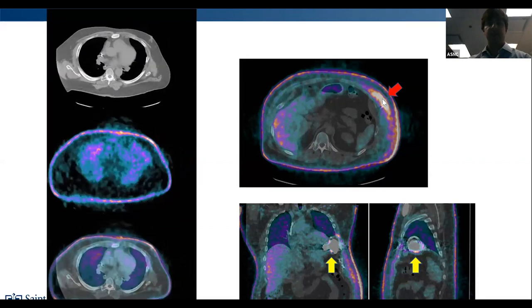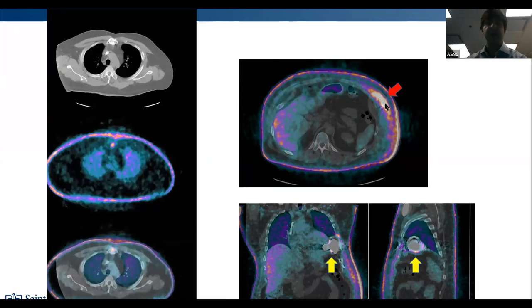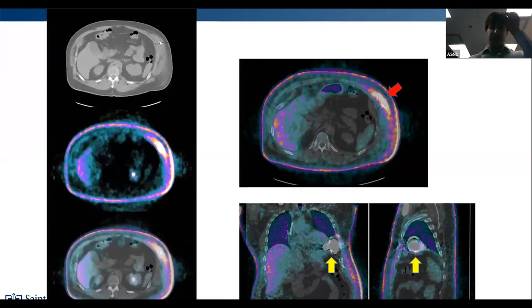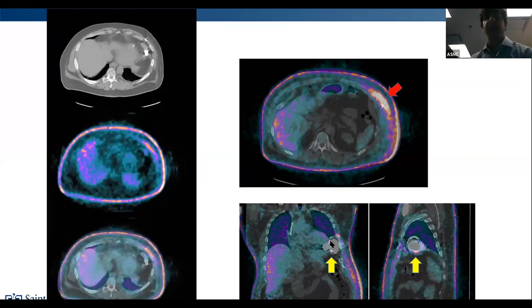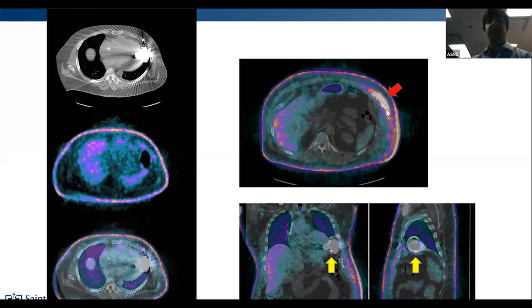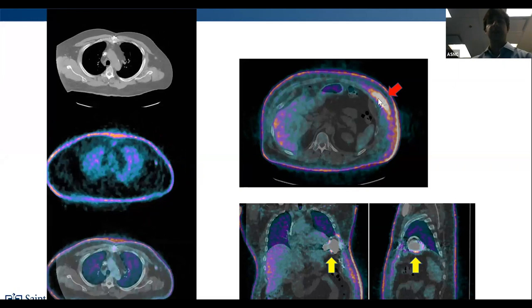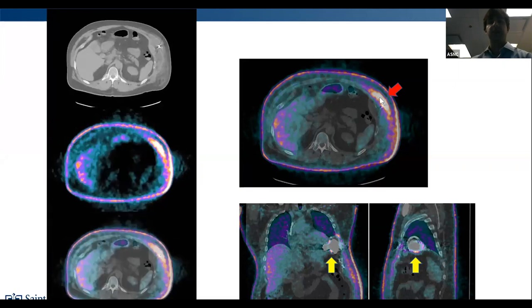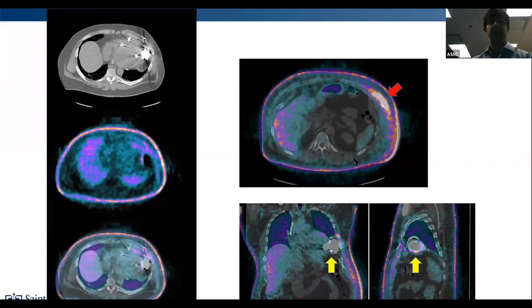There's attenuation corrected and uncorrected images. It's important to look at both sets of images, particularly around areas of the LVAD, because there can be major artifacts, obviously, when you use the attenuation correction, and the drive line and the outflow graft. So really look at both sets of images, but look at the uncorrected images. And what I'm showing you here throughout is the uncorrected images.